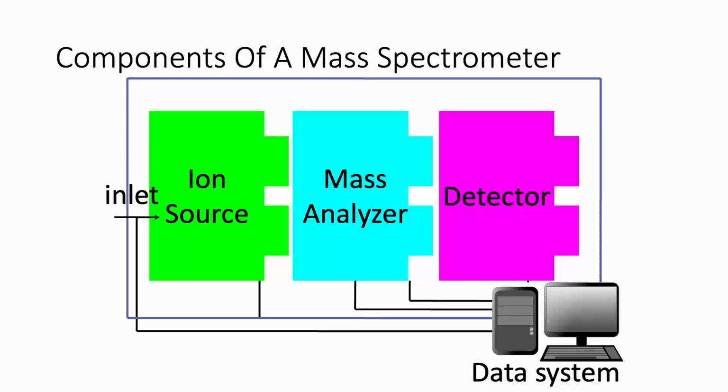It starts with the ion source, which is a reminder of transitioning from that compound dissolved in a liquid to an ion. Your mass analyzer is then able to filter or identify those ions based on their mass. And then at some point, you have to then detect the number of ions that get through or are coming through at a specific time.